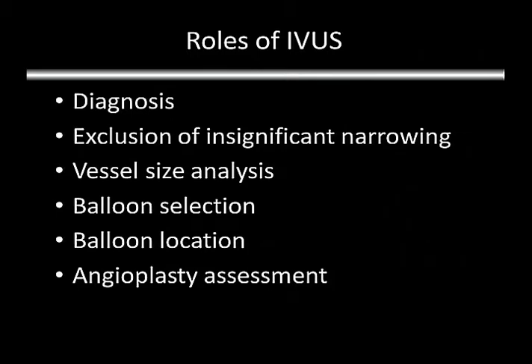So I did the whole procedure with IVUS. No contrast was ever used. And it was pretty straightforward. Used fluoroscopy, the IVUS. It showed me the diameter of the vein. I clearly delineated the area of stenosis, and the angioplasty was done, and the IVUS was put back in and shown to have a really wide open lumen, and the patient left in an hour. So it can be done without any contrast at all. So that's one role.